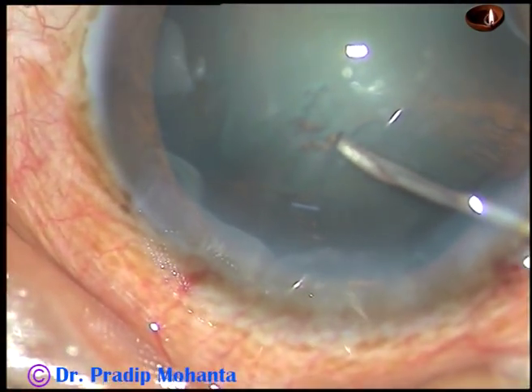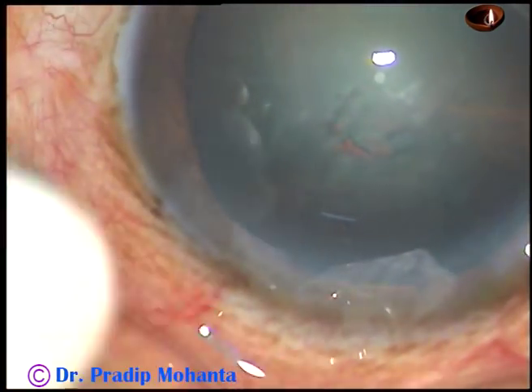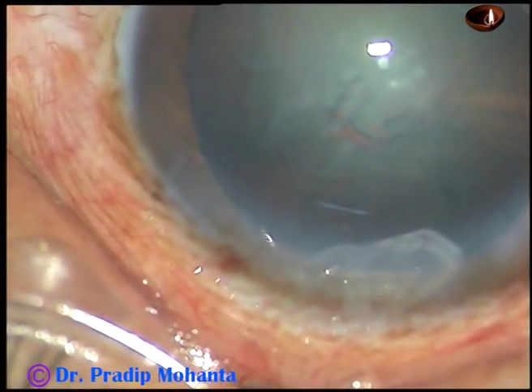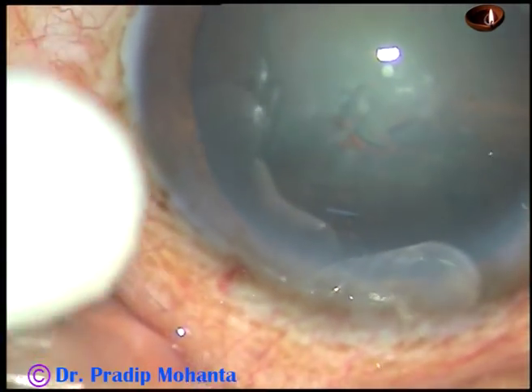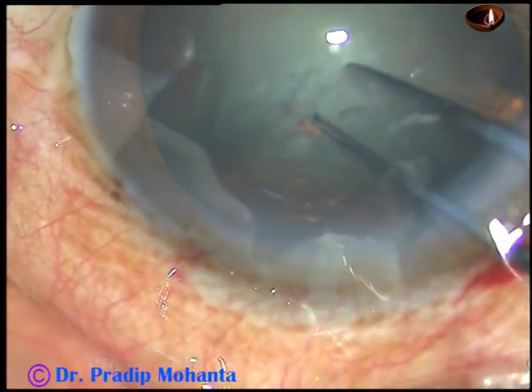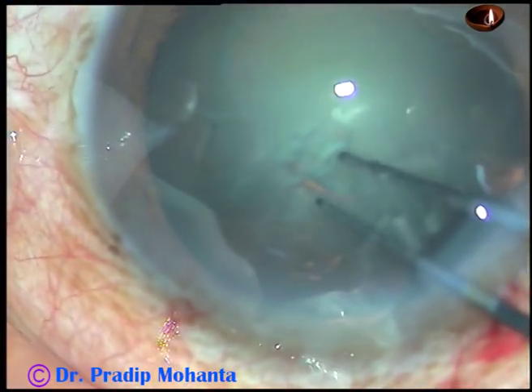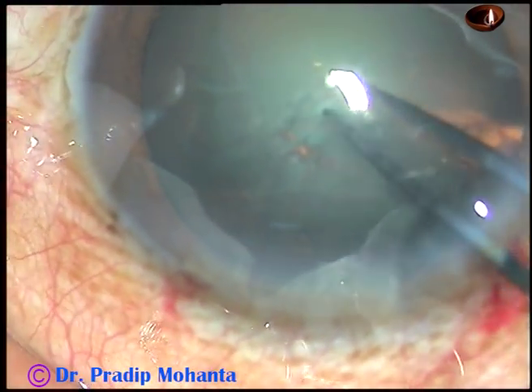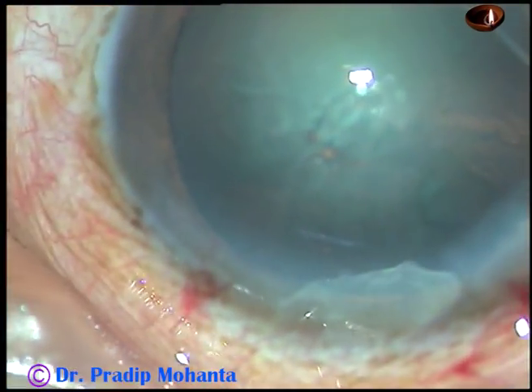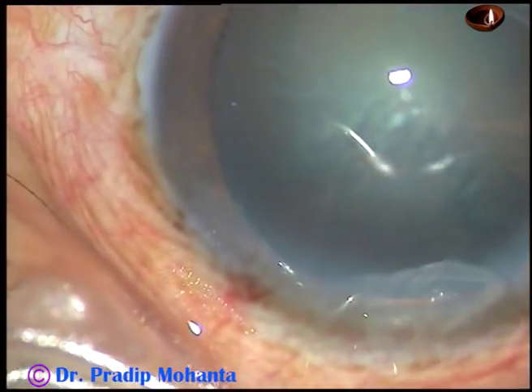I am not getting a good view, and I have to use trypan blue dye to do the rhexis. I cannot see the capsular tag properly, so I asked for trypan blue dye.